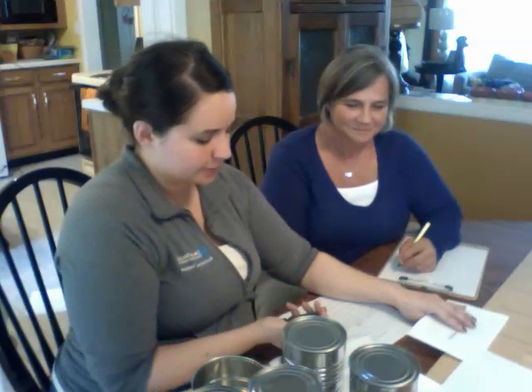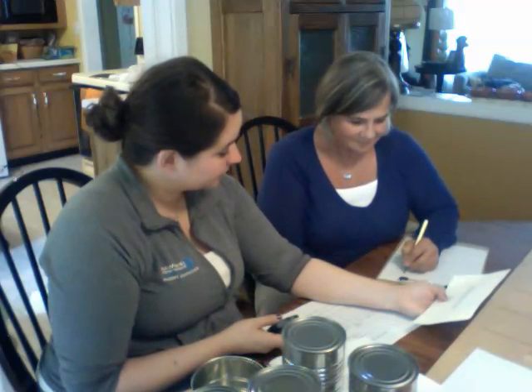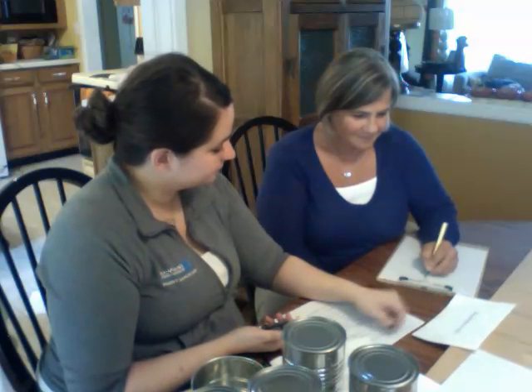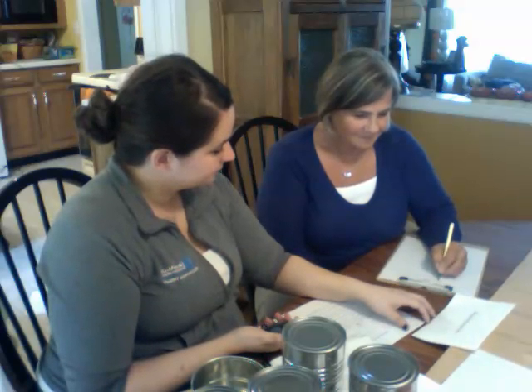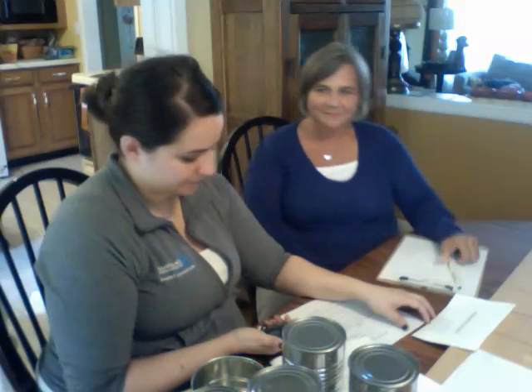All right, so we're going to go ahead and start. We're going to do the same thing, but this time using your dominant hand. So I've given you a different sentence. Are you ready to go? Yes. All right, set, go. Very good. You want to see your time?